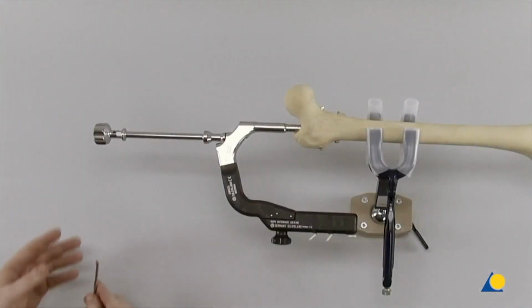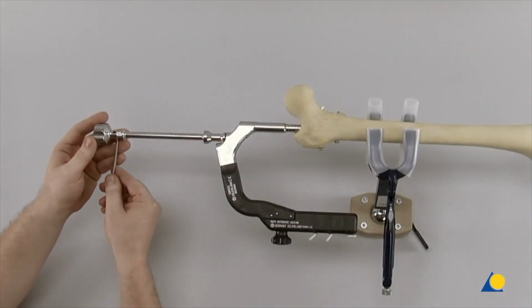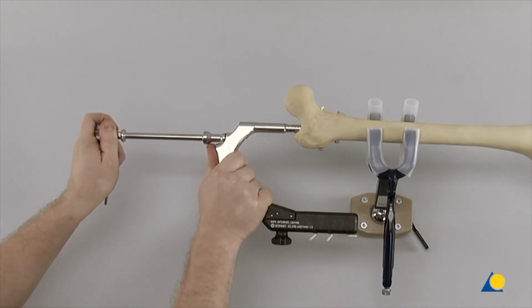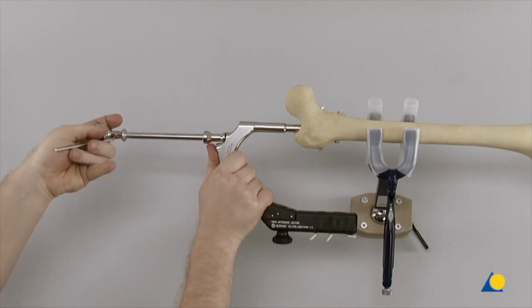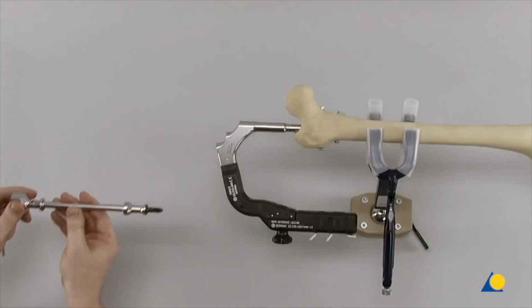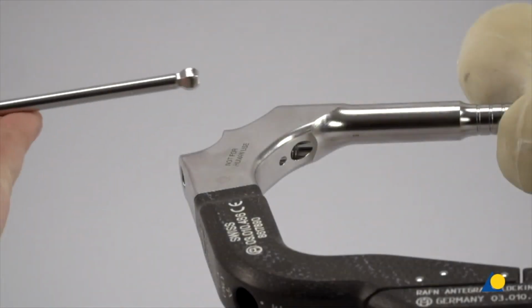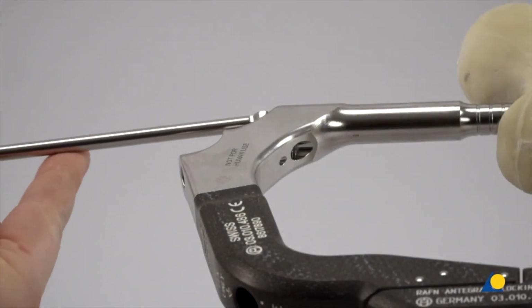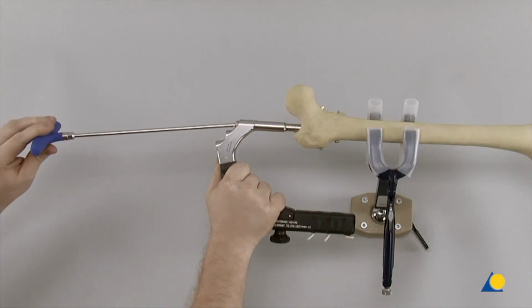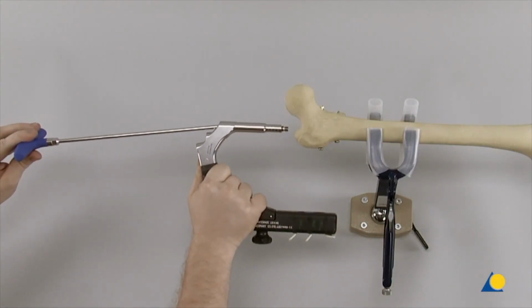The driving cap is removed with the assistance of the pin wrench. The T-handle screwdriver with spherical head is inserted into the insertion handle and turned counterclockwise to disengage the insertion handle and aiming arm.